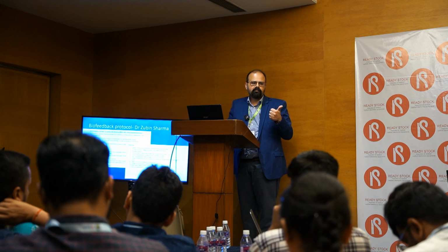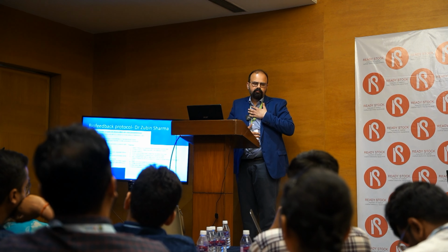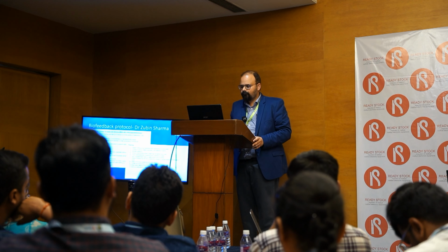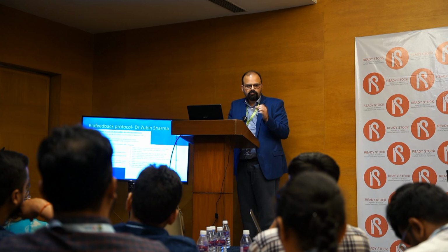First step is diaphragmatic breathing. You all know what diaphragmatic breathing is. One hand on the chest, one hand on the tummy. Inhale, the hand on the tummy goes up. You do it a few times, twice a day, if possible after meals. Then the first few sessions are squeeze and relax.